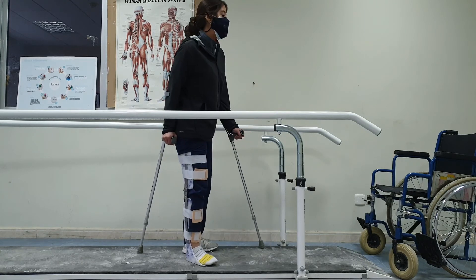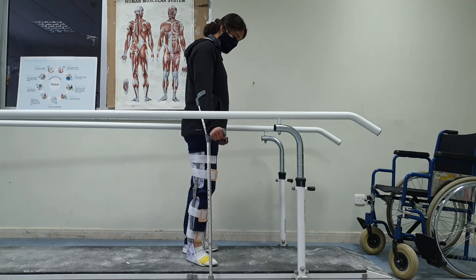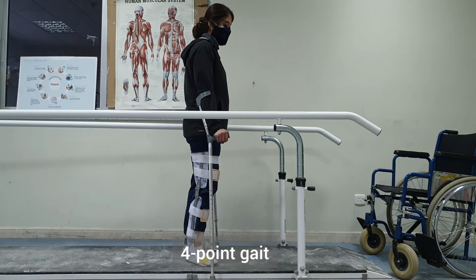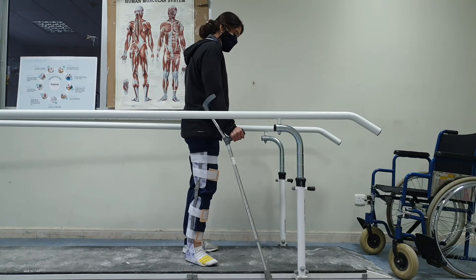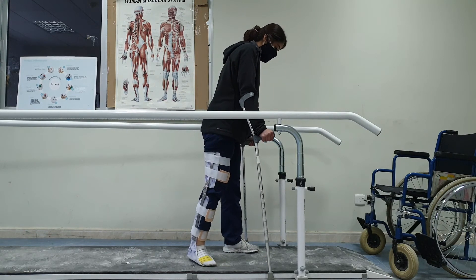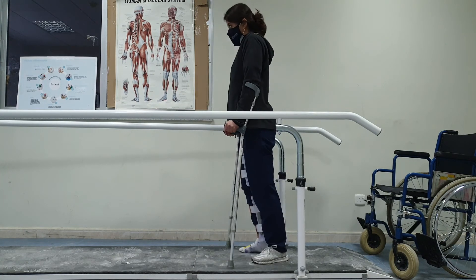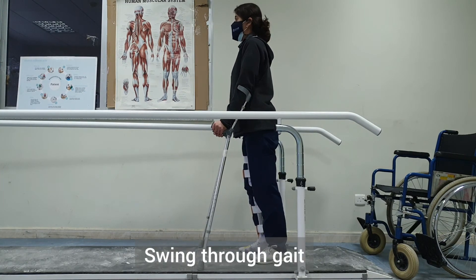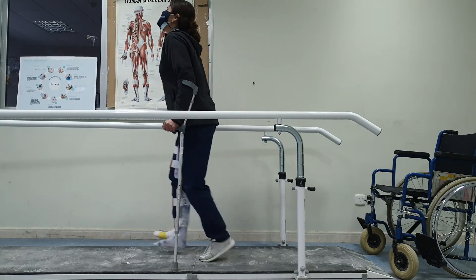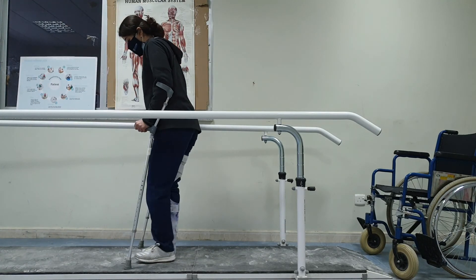Next we will do gait patterns. For the four-point gait: advance one crutch, then the contralateral leg, then the other crutch, then the other contralateral leg. For the swing-through gait: advance both crutches forward, do a push-up, and advance the body through. The first variation is swing-to, and the second is swing-through.